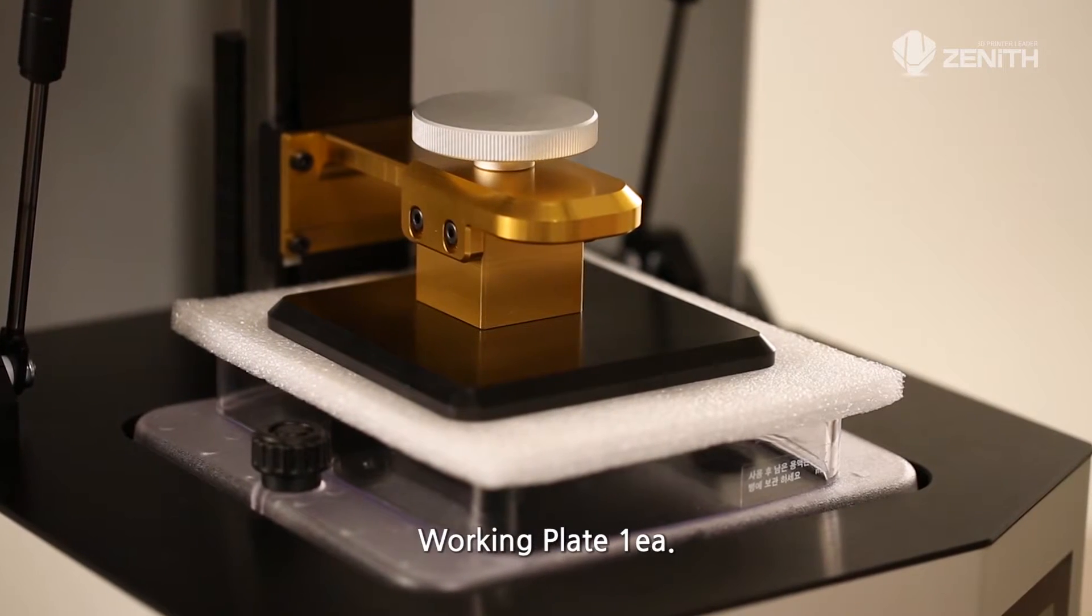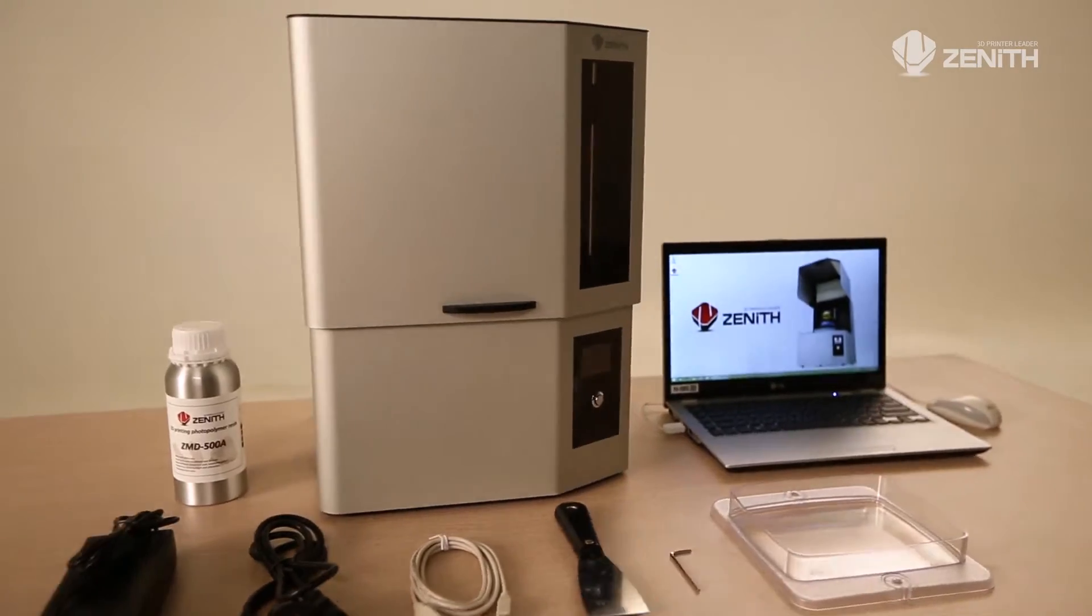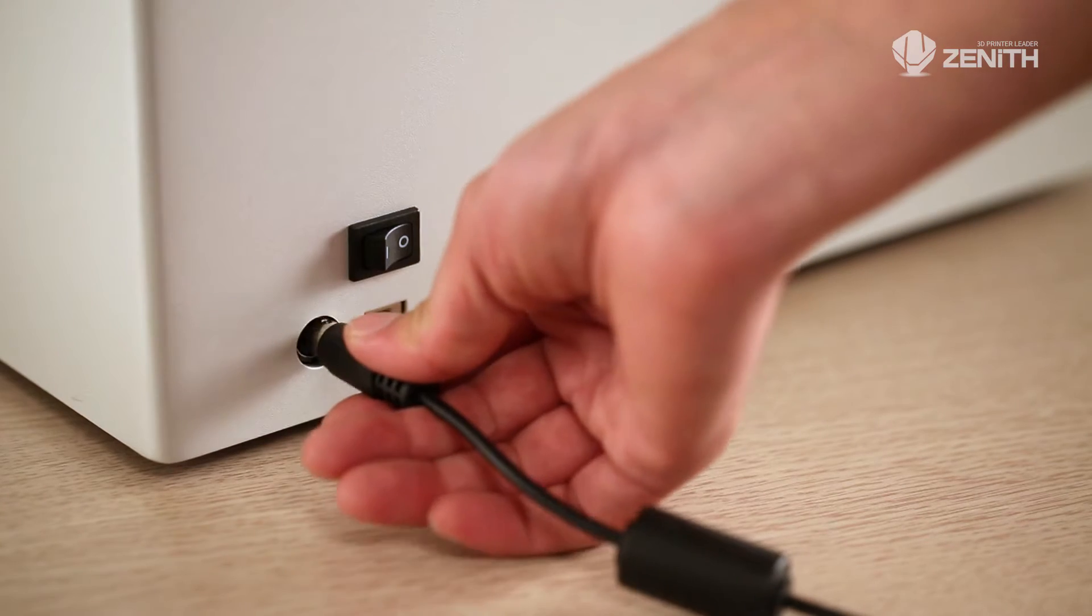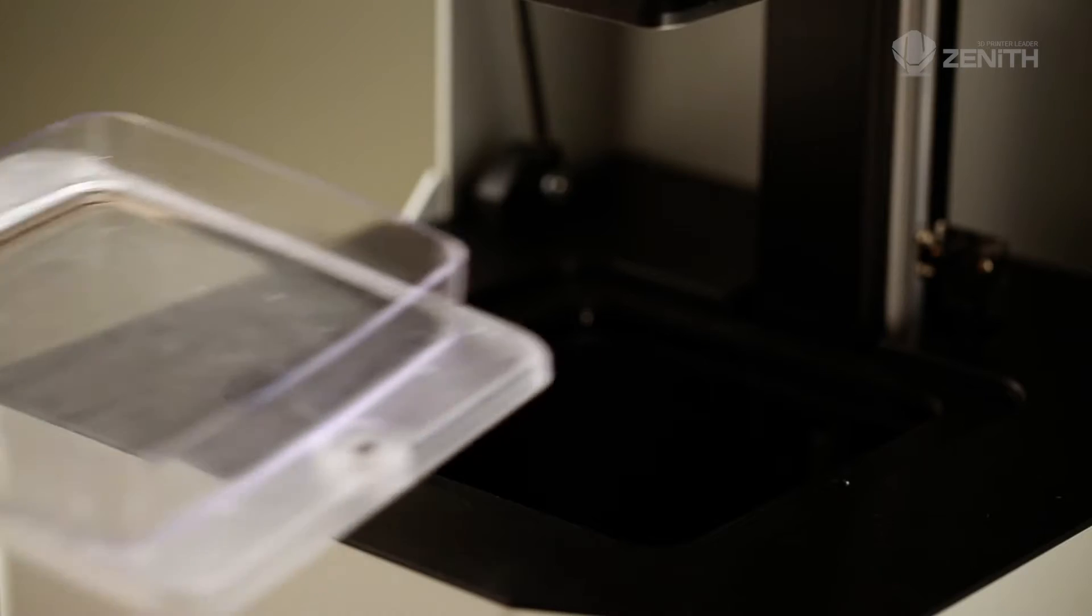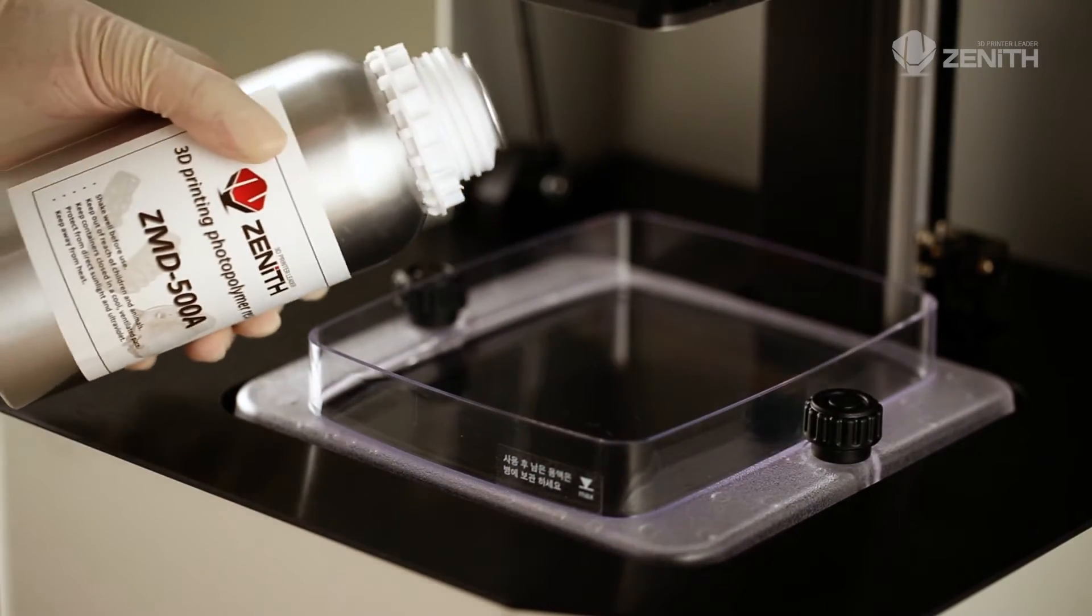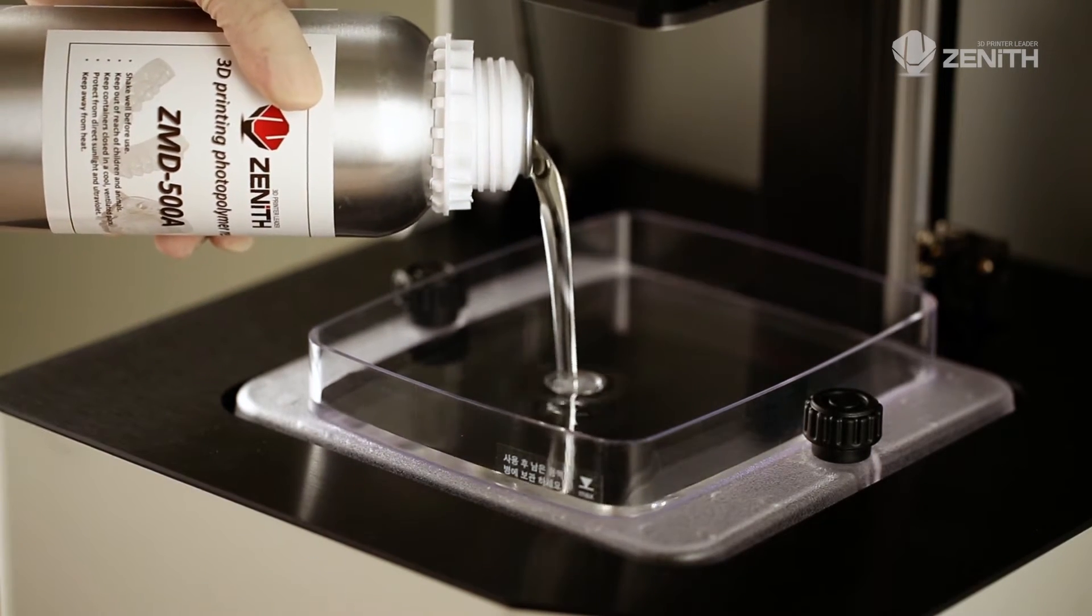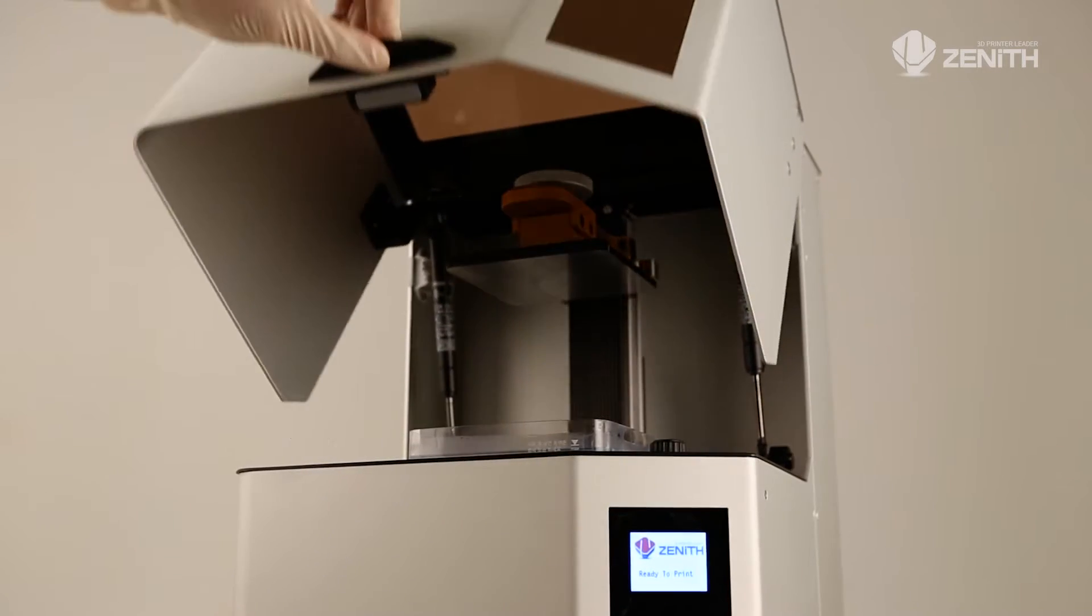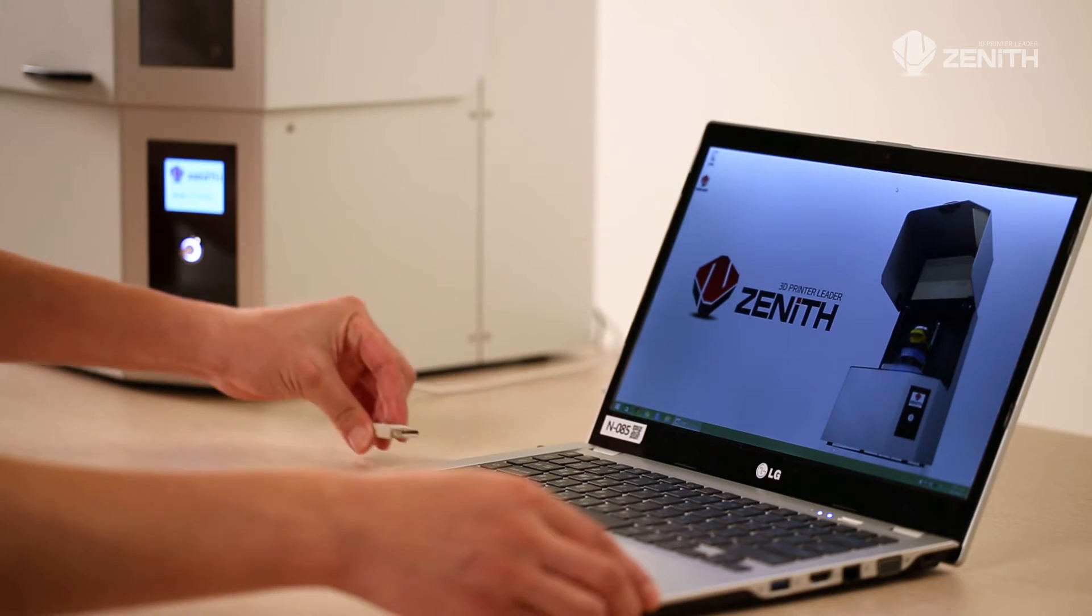Connect the power adapter to the main body and turn on the power switch on the rear side. Insert materials into the machine according to the purpose and close the case. Connect the USB cable to the equipment and a PC.